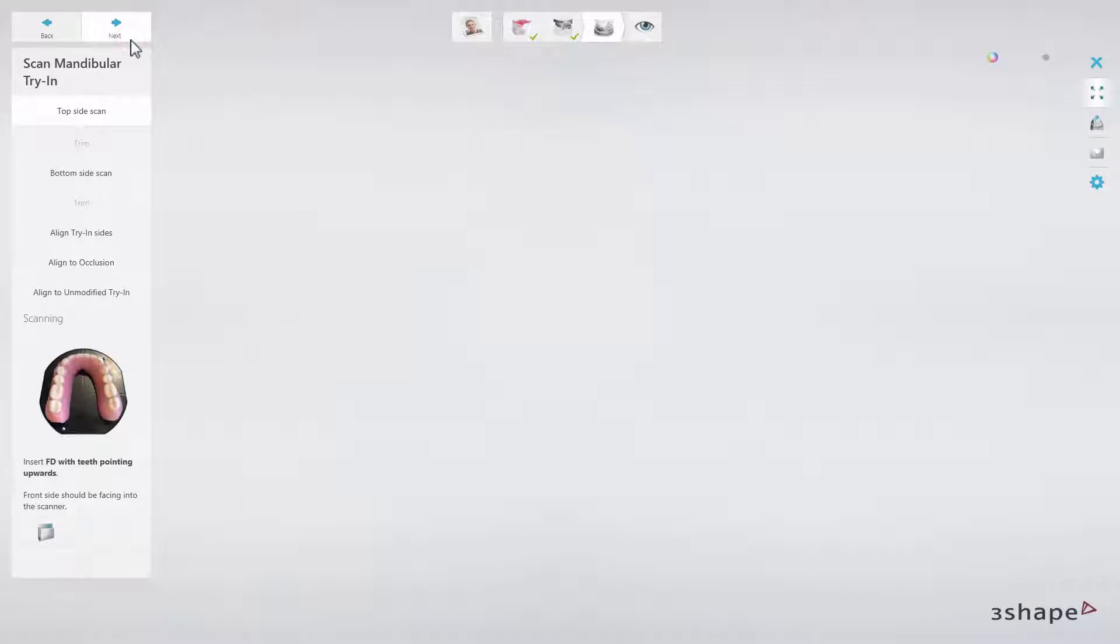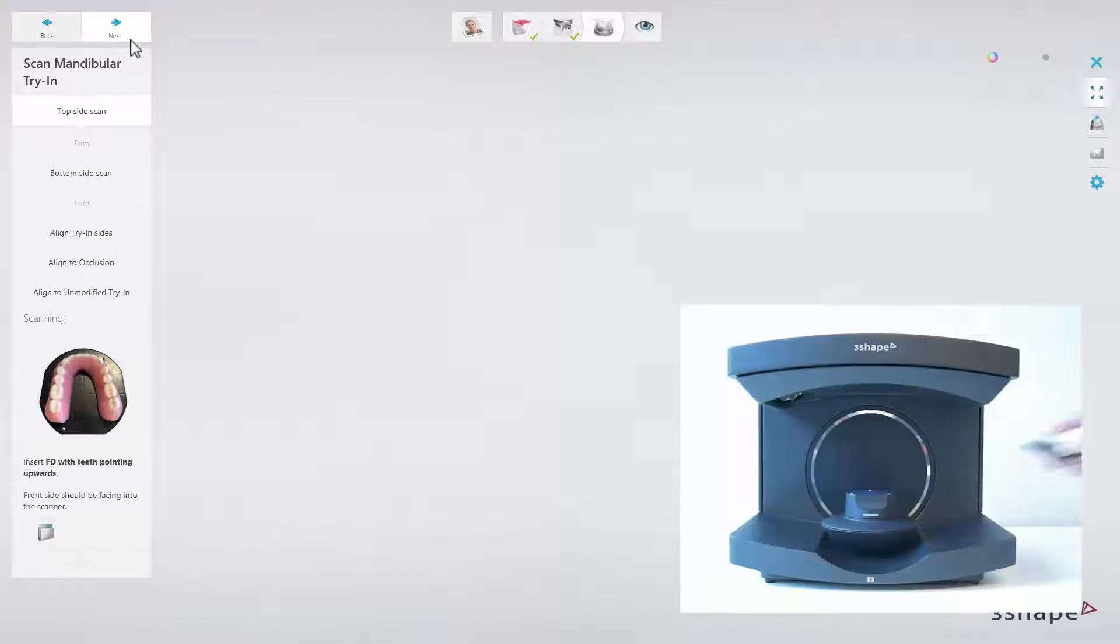Then click next to go to scan mandibular try-in. Mount the mandibular try-in on the plate having teeth facing upwards. The model has to be tilted in the same manner like the upper denture. Insert the plate into the scanner.